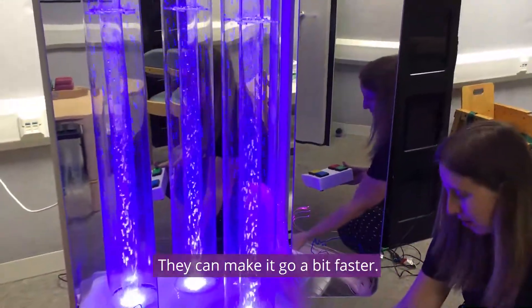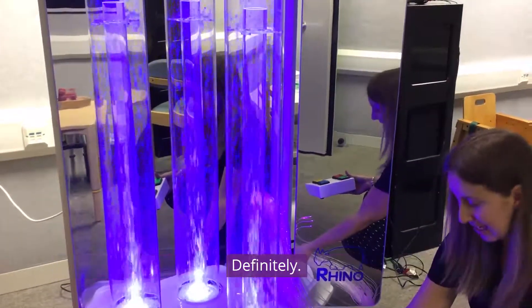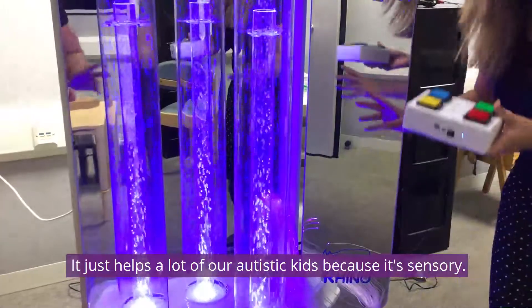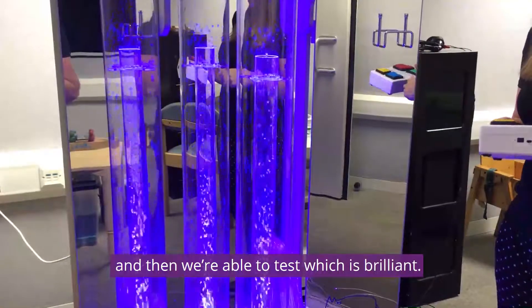We can make it go a bit faster. And you said that it's kind of helped the children already who've used it? Definitely. So it just helps a lot of our autistic kids, because it's sensory — they don't like their ears being touched, so we keep them distracted with this, and then we're able to test, which is brilliant.